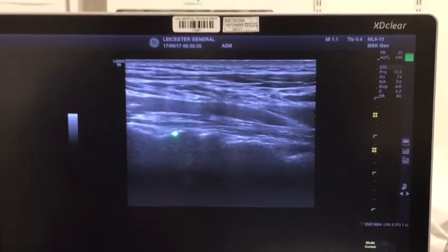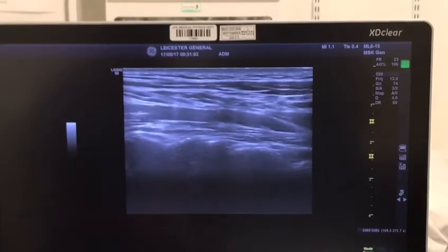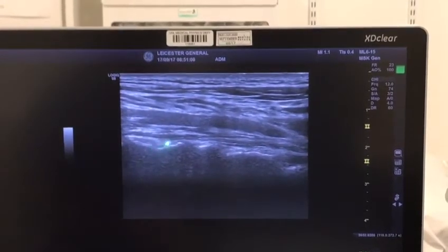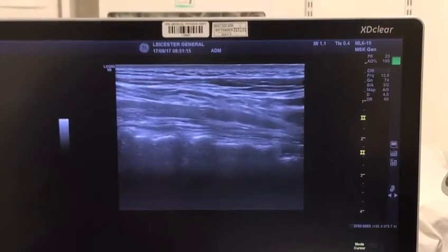If you want to perform the cervical facet joint injections, you will bring the needle out of plane onto there, and if you want to perform the cervical medial branch block, it will be in the trough, and you will lift off the splenius capitis muscle, and it's usually about half a ml of local anesthetic, and I use a 25 gauge needle to perform this block.